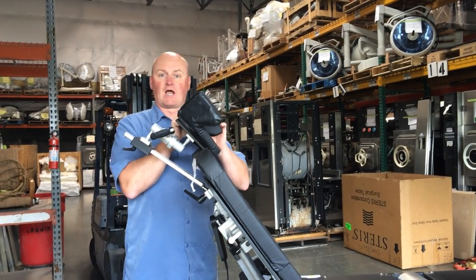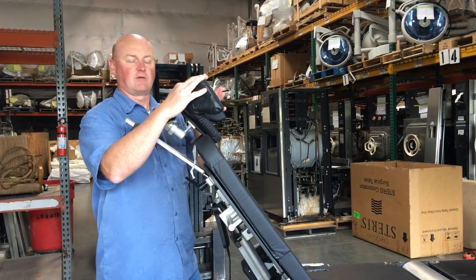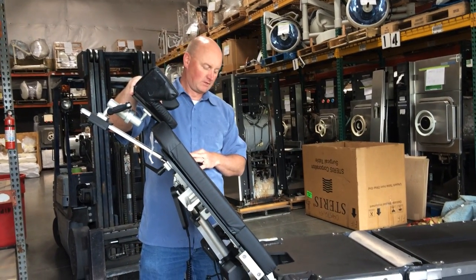The disposable straps are in the box. You'll just strap those around here to get the head stable. And like I said, you can position this anywhere you want.